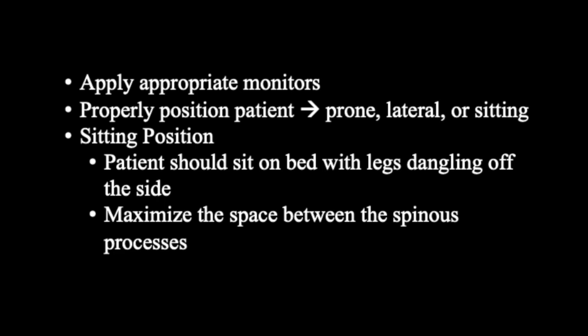The patient can be placed prone, lateral, or in the sitting position. However, this video will demonstrate placement in the sitting position. The patient should sit on the bed with legs dangling off the side. To maximize the space between the spinous processes, the patient should arch the back into a C shape.